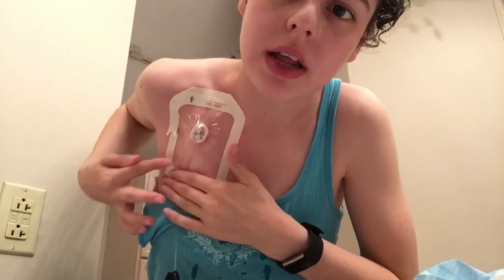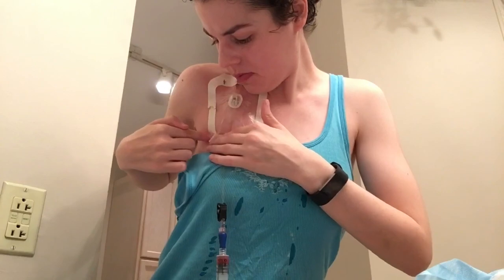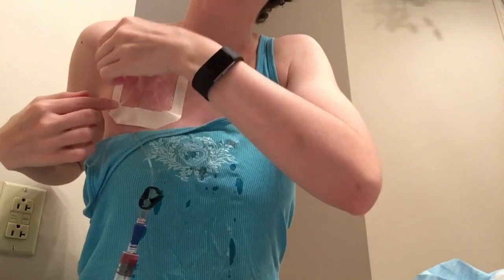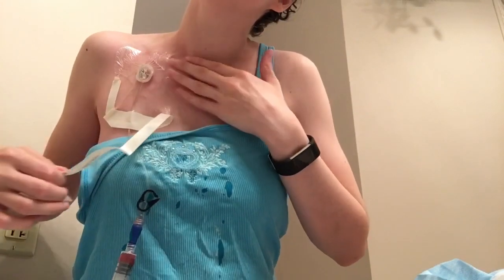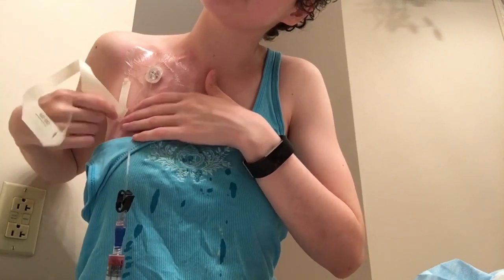And since this is covered, I don't know how surgeons have these on for 8 hours because my face was getting so hot. I just push this on a lot. If it's not on well, the edges of the tegaderm will be white instead of clear. So there's a tiny little overlap there, but it's not a big deal. I'll be reaccessing next Thursday because that's just when I timed out that I needed the antibiotics and got accessed.